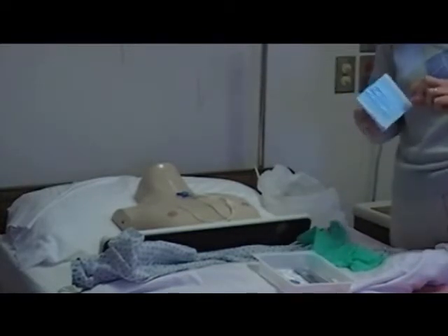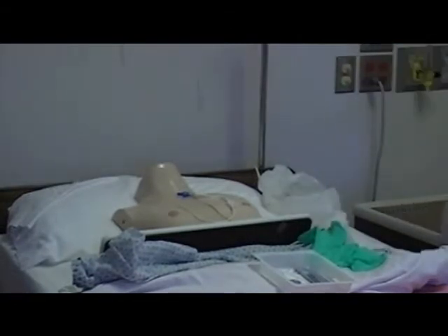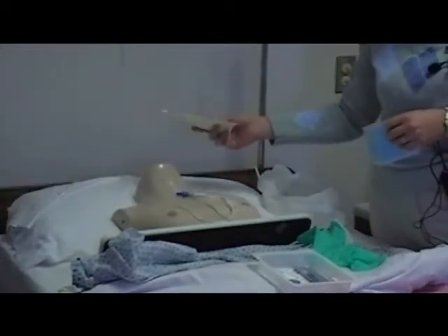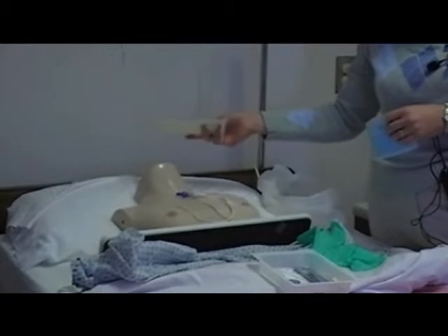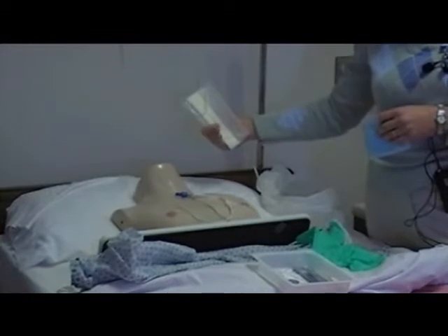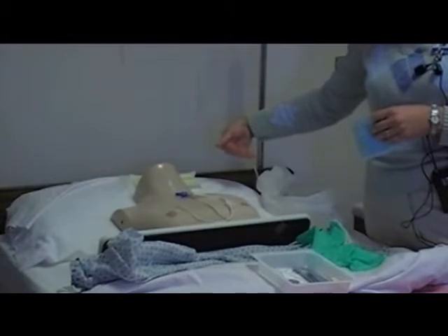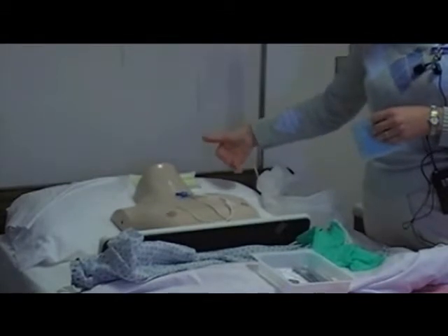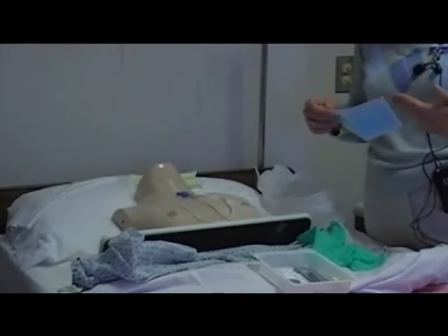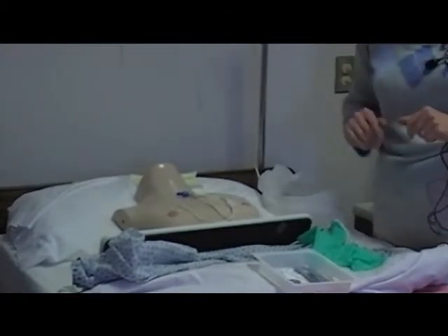The mask is for me. I've also brought extra masks so that I can give one to my assistant, and I'll also give a mask to my patient. But if my patient is unable to tolerate a mask, if his respirations are compromised, I'm going to have him turn his head away from the insertion site. So with it being on this side, he's going to turn his head towards me. Now before I take that dressing off, I'm going to put on my mask at this point. So just so that you can still hear me, I will not put the mask on, but I pretend I've got the mask on at this point. Everybody else is also masked up right now.